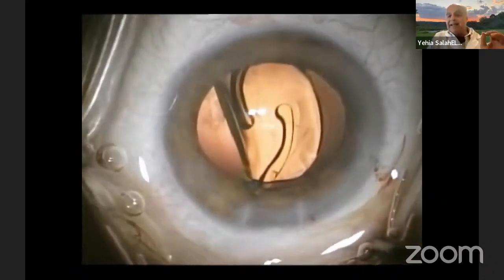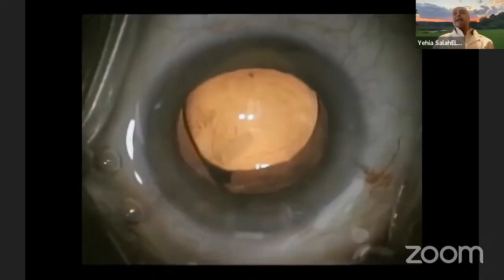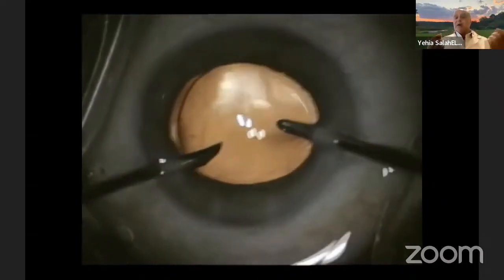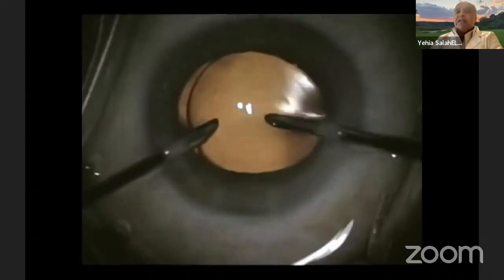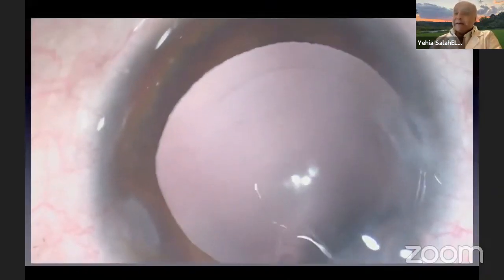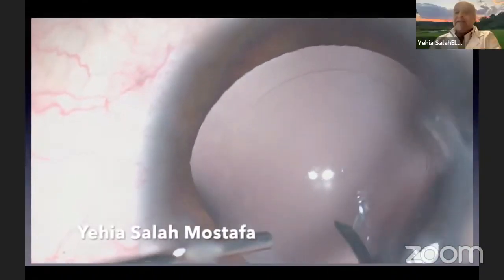This is the mainstay in clear lens extraction, whether for younger patients or presbyopic patients. They have to know what to expect. And doing the surgery bilaterally, particularly in cases of extended depth of focus, you can adjust the power that you can give them, even a nearer or closer range of focus so they can read. Like this is Vivity, for example, you can adjust the other eye to be on the myopic side. Myopic half diopter, so you give them range.